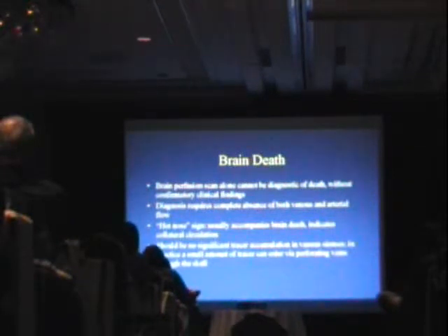But it's important to know that the brain death study we do is not diagnostic of brain death. It's only one thing that's used to confirm brain death by the clinicians. That's a clinical diagnosis. The study requires complete absence of arterial and venous activity. You may see a little bit of trivial uptake in the sagittal sinus due to perforator veins, but other than that, there should be no evidence of any activity within any phase of the study.